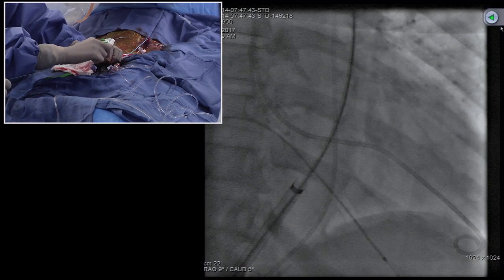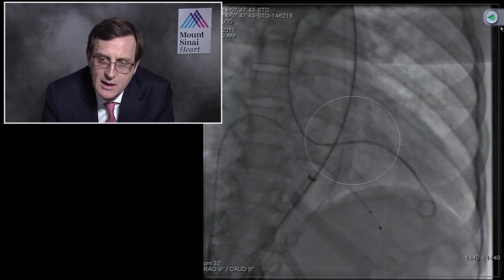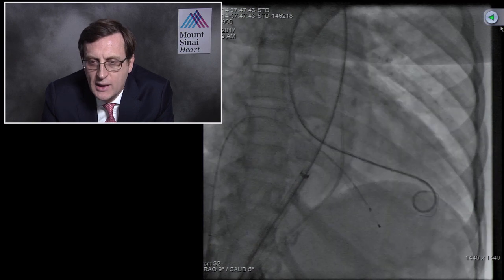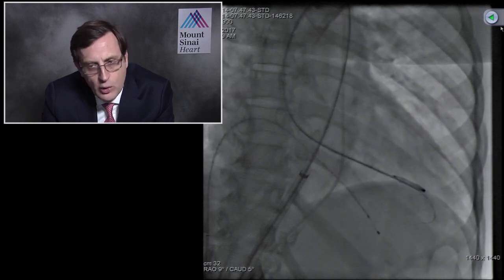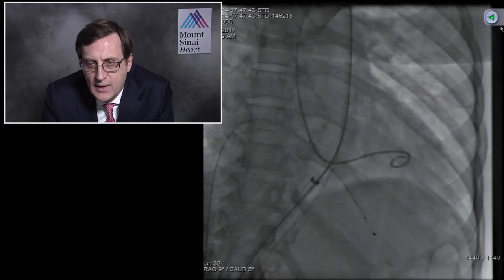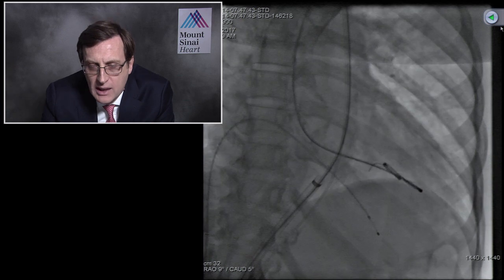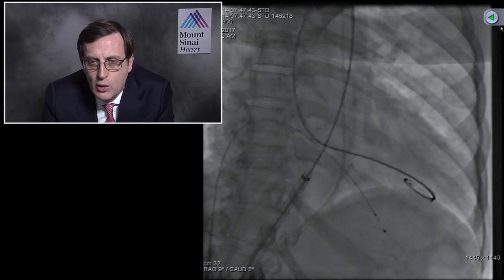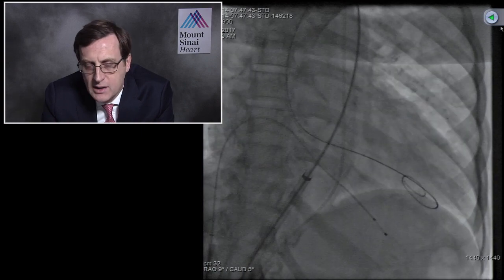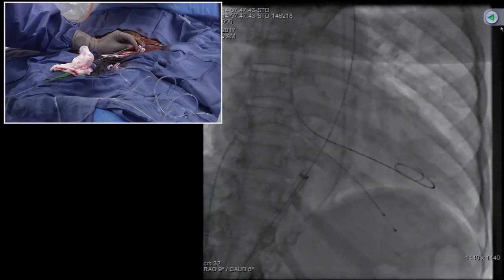Issue, particularly with this calcification and the very stiff vessels. Delivering the catheters initially and all that, not the easiest one to manipulate. And there's no need to push and take risks with the stiff wires before you have safely got a pigtail in. And again, you can see from the horizontal aortic valve in combination with a non-distensible aorta, how difficult it is to manipulate these wires live. You have to be very, very experienced to get those safely.